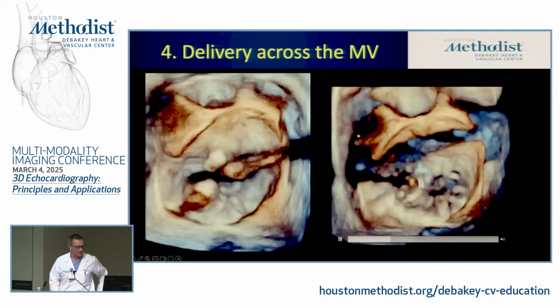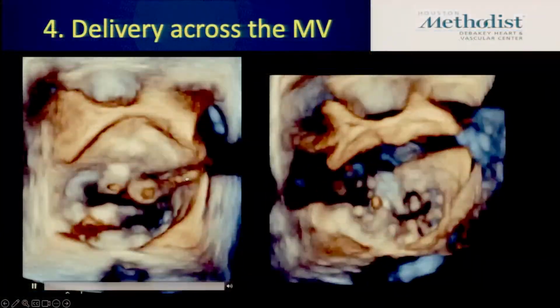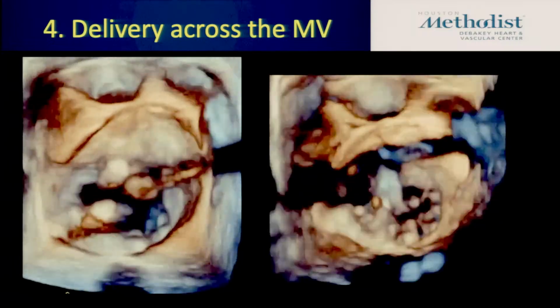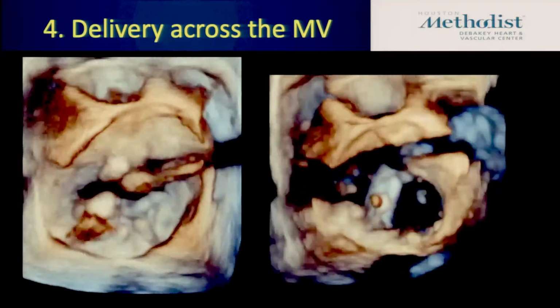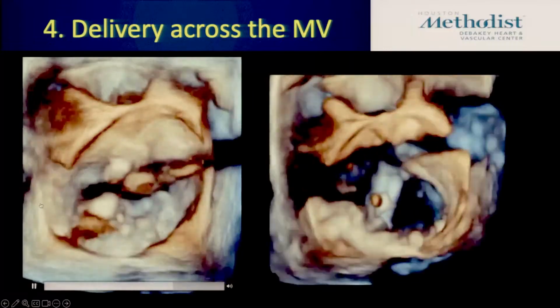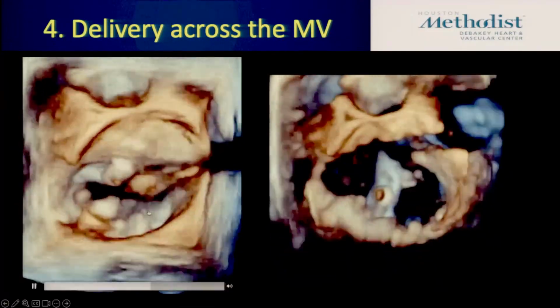But here we are. So again, the 3D elements. So we're positioning. There's this massive black line here, and that is not a tear. It's not a problem. It's the shadow. So we're imaging from the top down, and the catheter gets in the way, and sometimes you can't avoid that because you can't move the esophagus. So you just understand there's a shadow. You can manipulate and move your frame a little bit to try to negate that.